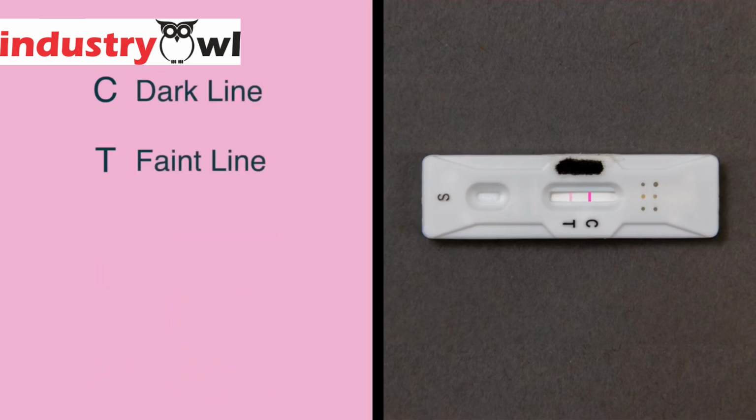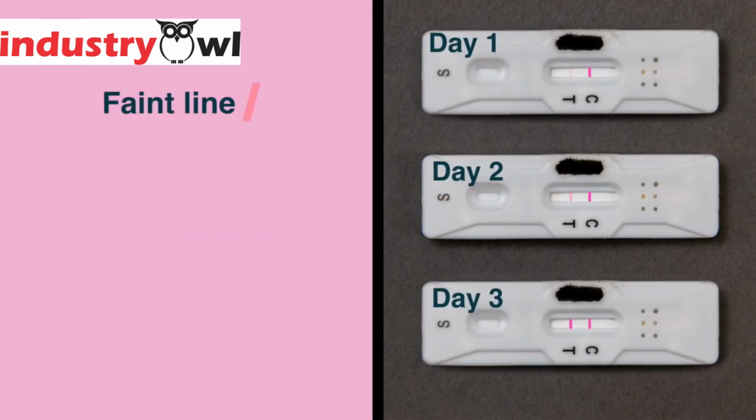If you get no lines, the test is invalid. Please test with another device.